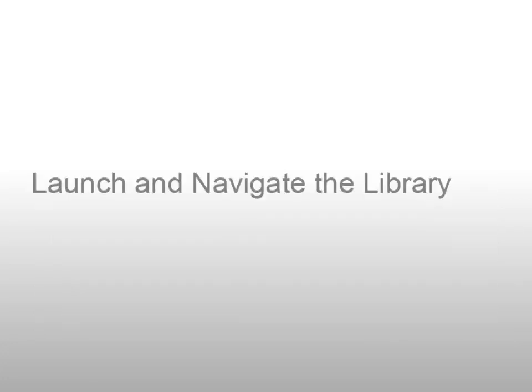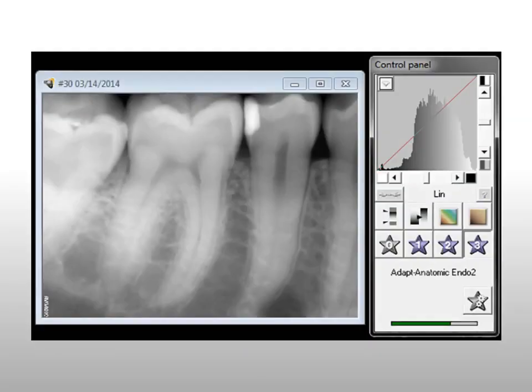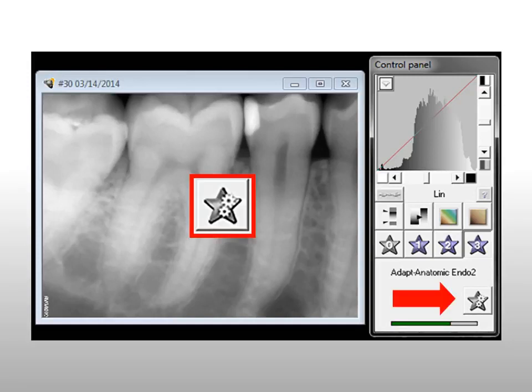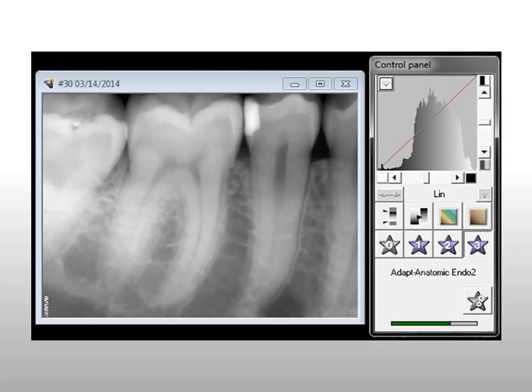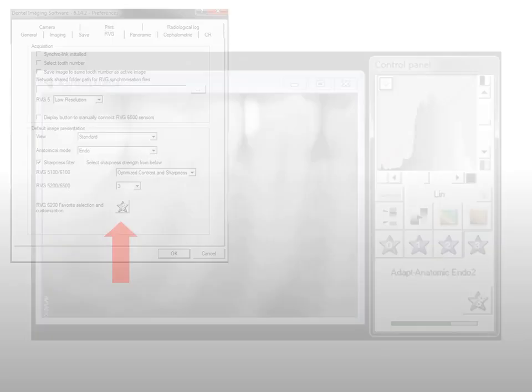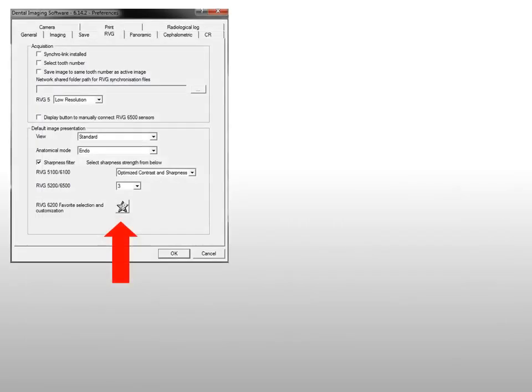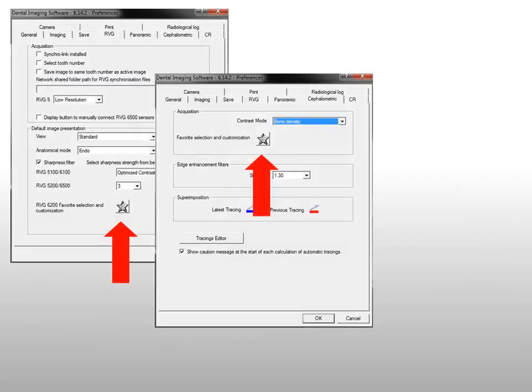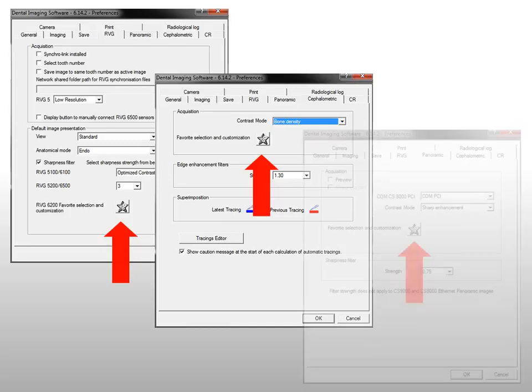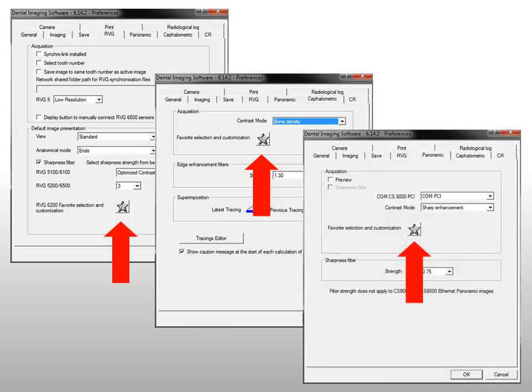Launch and navigate the CS ADAPT library. To launch the filter library, click the CS ADAPT library button. The library can also be accessed from the RVG, cephalometric, or panoramic tabs in the Preferences window.